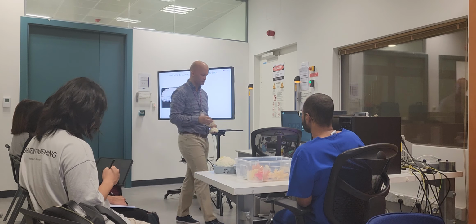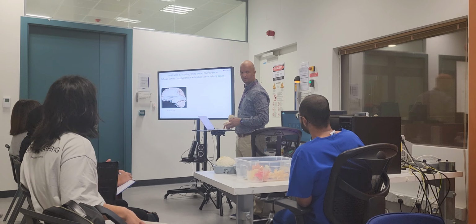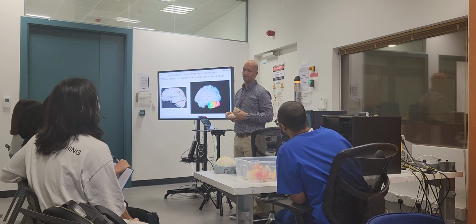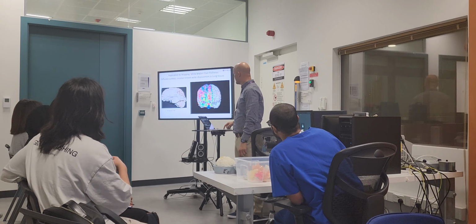Or you can put it in an MRI scanner. You study diffusion imaging. We do a diffusion sequence, we encode diffusion in 3 dimensions, and we can do this in about 3-4 minutes. So we can do virtual dissection in a few minutes.